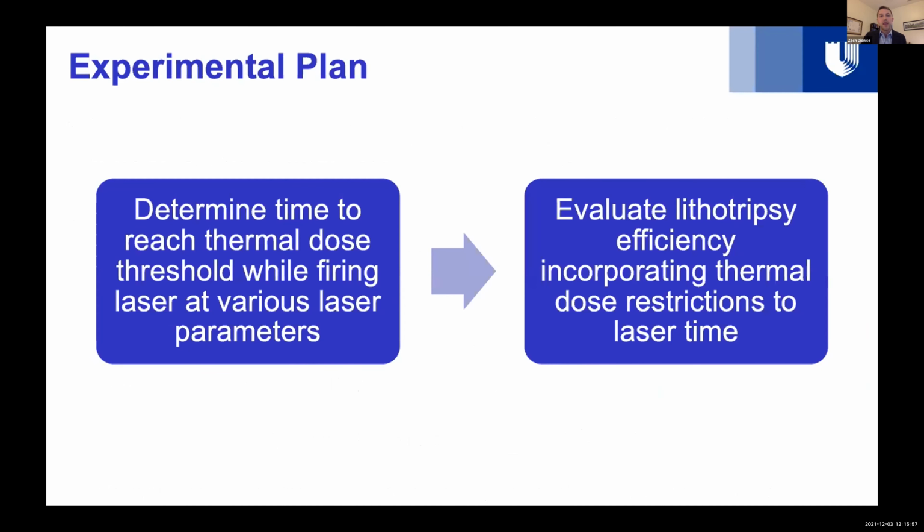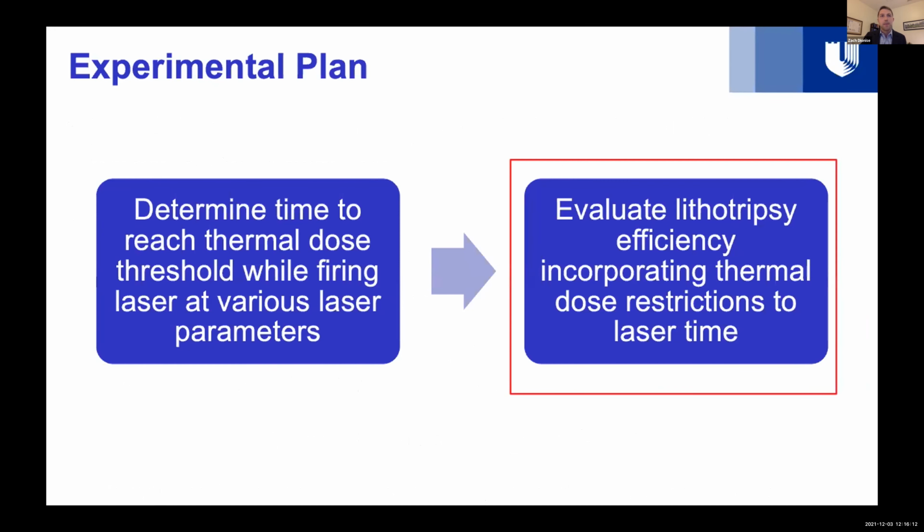Therefore, our experimental plan was twofold. First, determine the time to reach thermal dose threshold while firing lasers at various laser and irrigation parameters. And then second, evaluate lithotripsy efficiency, incorporating thermal dose restrictions to lasering time. And we'll focus on the second part today.